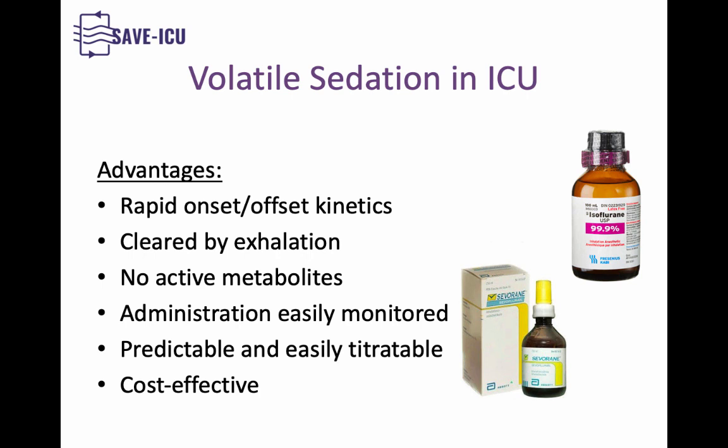The other advantage is the ability to monitor how much you are giving and what concentration is in the patient's body. With inhalational agents, you can actually monitor end-tidal concentrations, which will very closely approximate brain concentrations. You can't easily monitor how much you're giving with other agents, like for example propofol or opioids or midazolam.